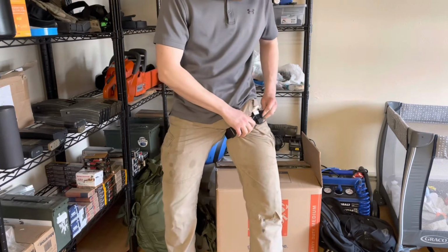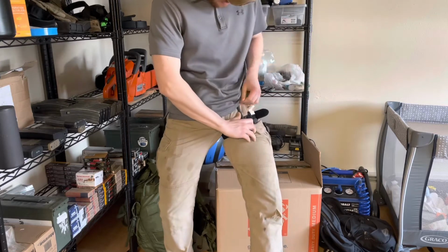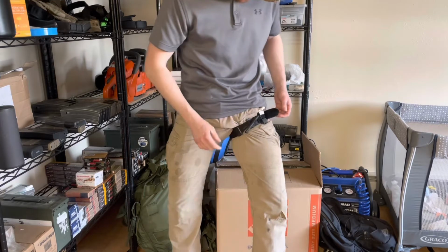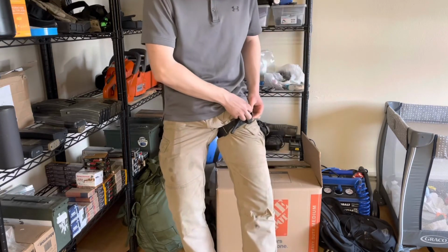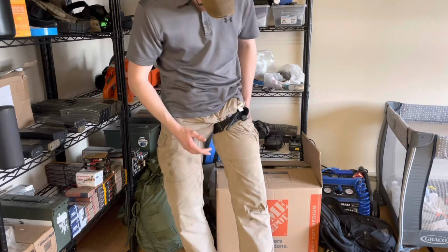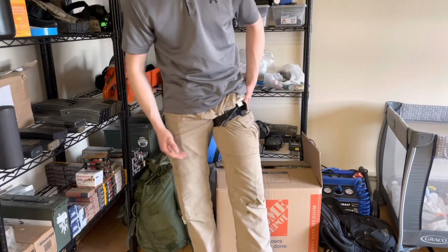And then you're going to take your windlass. And see that? I've only done a half a rotation. And that is already incredibly tight. And the level, it's hard to describe if you've never felt it, but the level of tight we're talking is incredible.